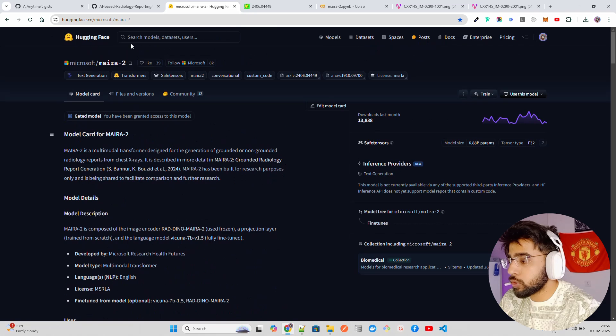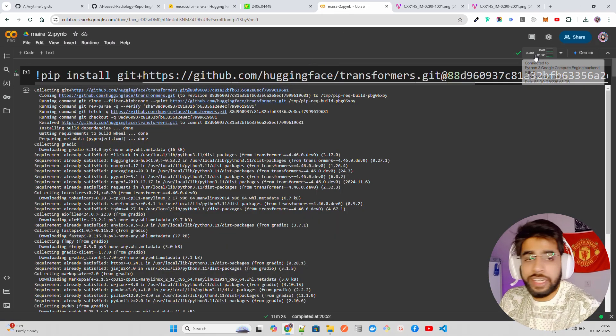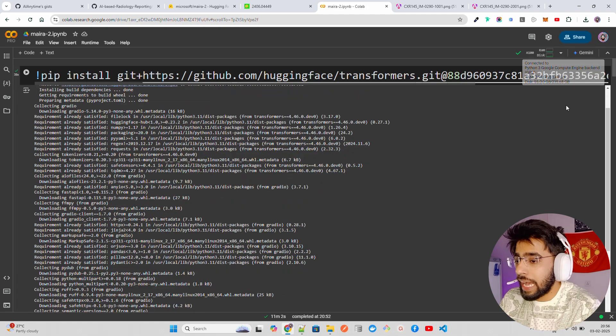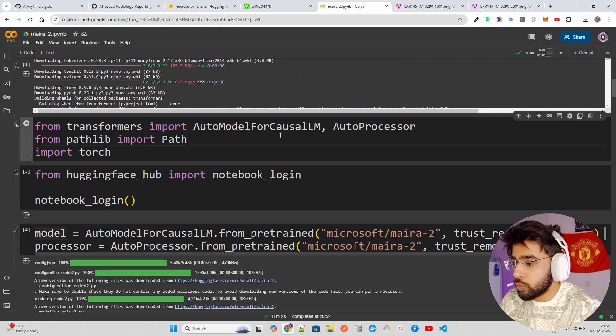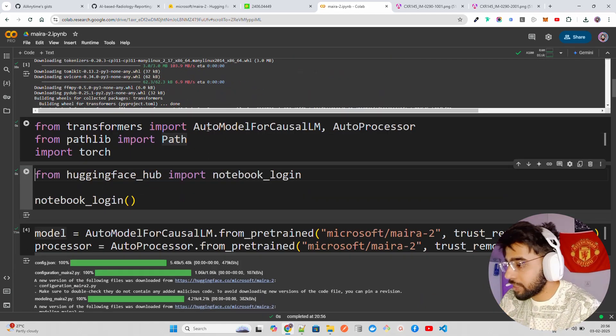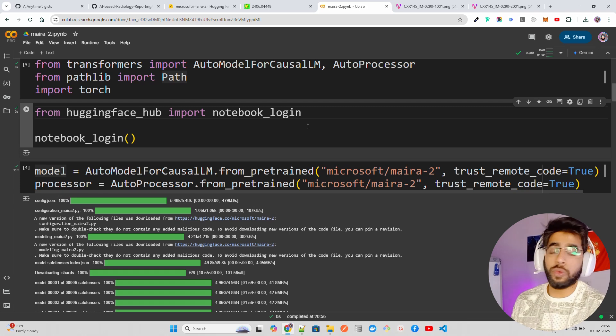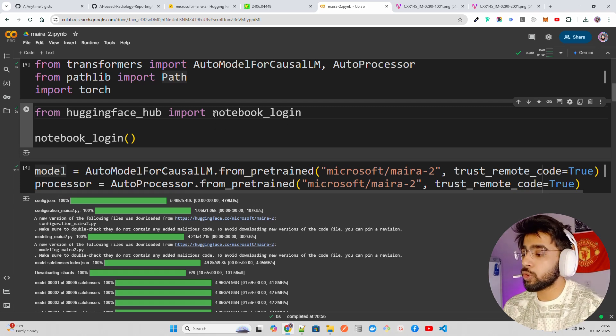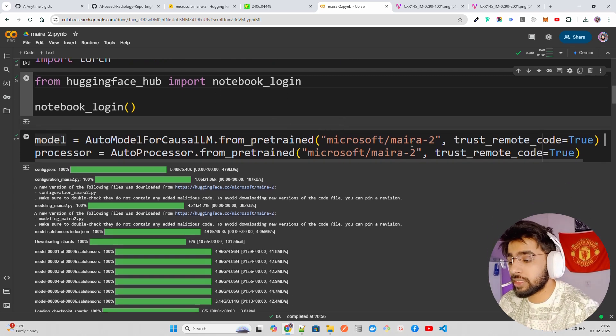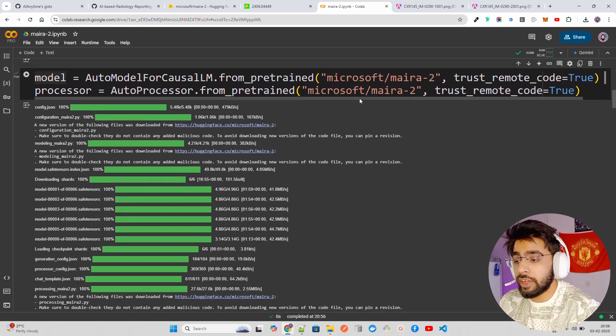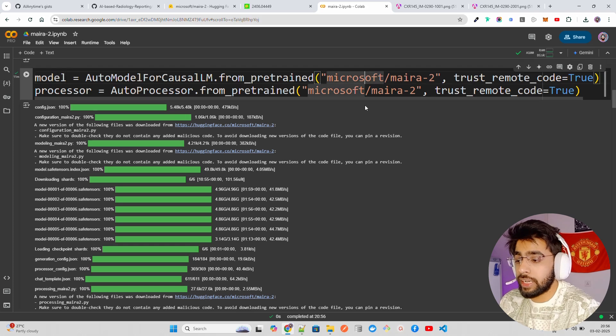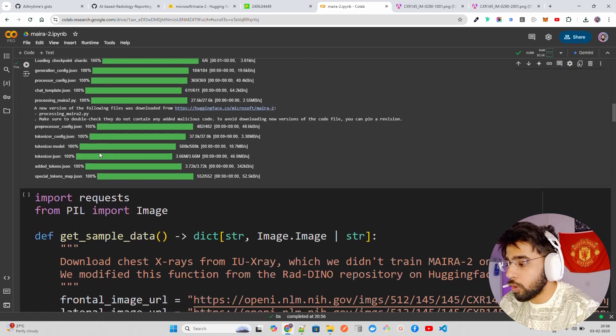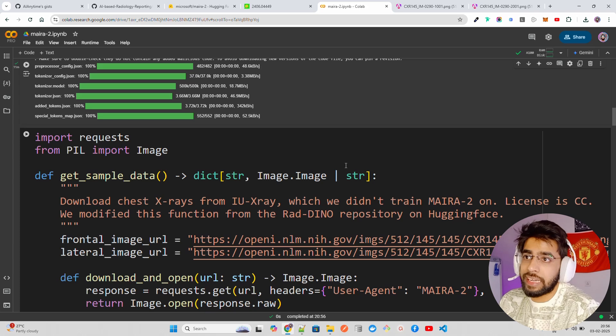It only works with English reports right now. I'm already running this on a T4 GPU on my Google Colab. I'll give you this notebook. You first have to log in with your Hugging Face hub because it's a gated model. You need to first log in and then you can get it. I already have downloaded the model, you can see the model has been loaded.